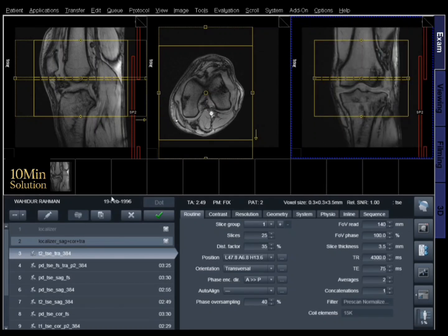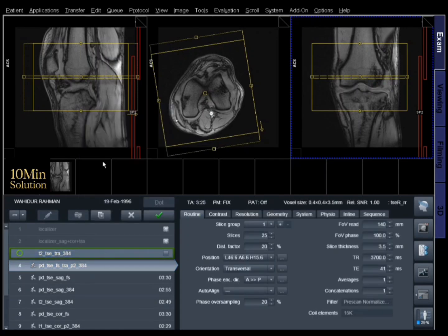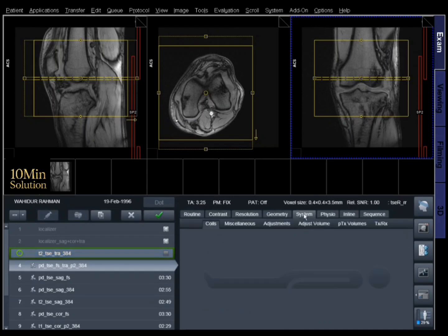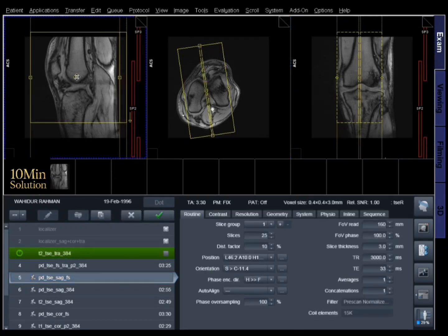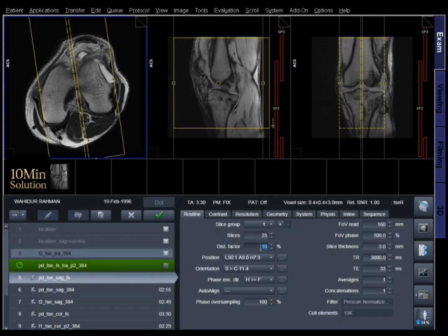The articular cartilage is carefully evaluated for its thickness and integrity, which is essential in detecting cartilage defects, thinning, and degenerative changes. Special attention is given to the menisci, namely the medial and lateral meniscus. Evaluation of the anterior horn, body, and posterior horn helps in diagnosing meniscal tears, degeneration, or displacement.